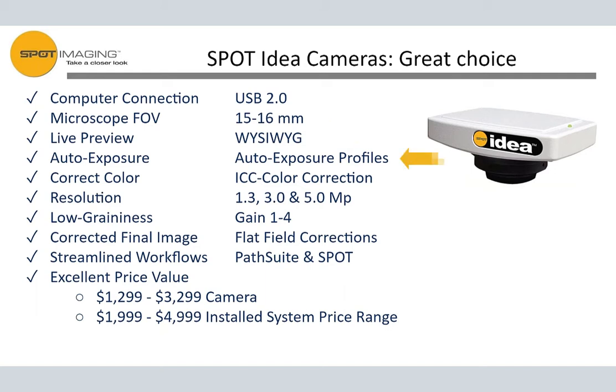It's auto exposure, so we have profiles. The way this one works is that it periodically pauses the image, recalculates an exposure, and updates for you. So it generally updates its exposure about every 2 or 3 seconds. Then you have color correction. It has the ICC color correction.